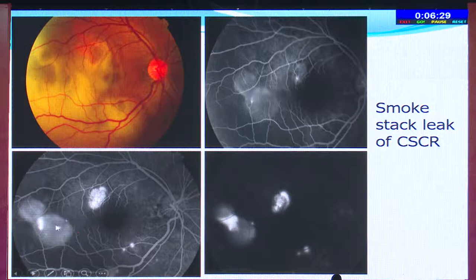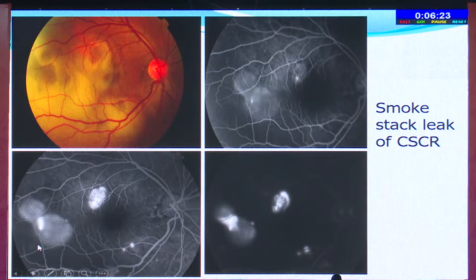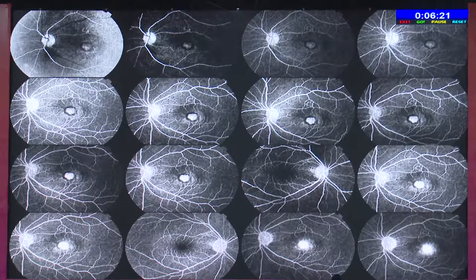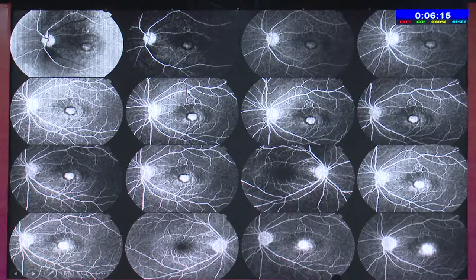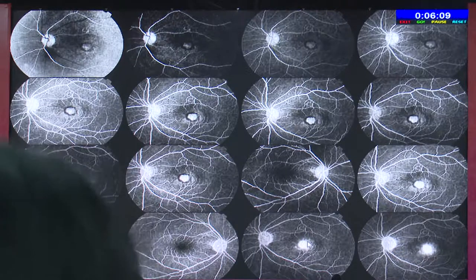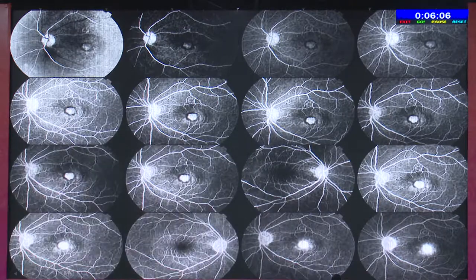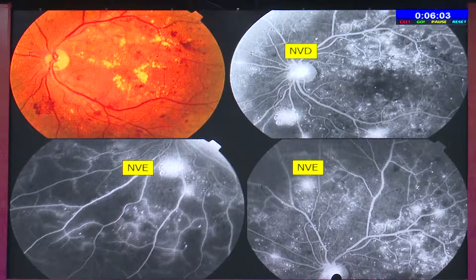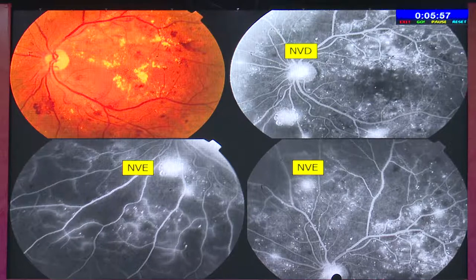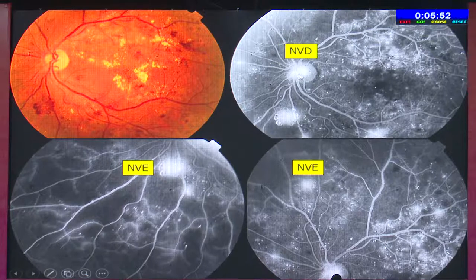In the later phases of the angiogram, you get pooling, which is another type of hyperfluorescence. Another hyperfluorescence of leakage type is the classic CNVM, which shows a cartwheel appearance in the early phases of the angiogram. As the angiogram progresses, the intensity of the fluorescence increases and the margins become fuzzy. In diabetic retinopathy at the proliferative stage, you get leakage from new vessels — neovascularization at the disc (NVD) or elsewhere (NVE).